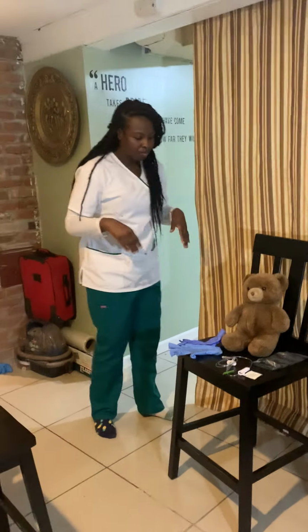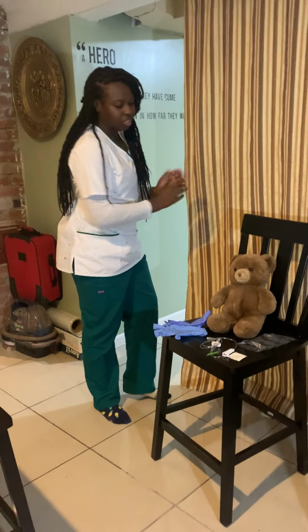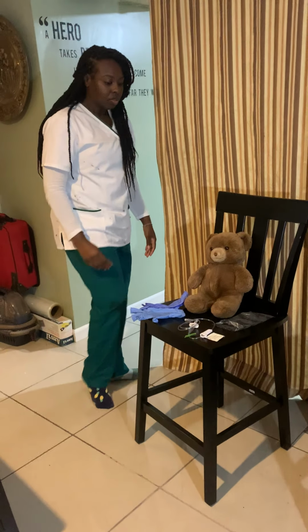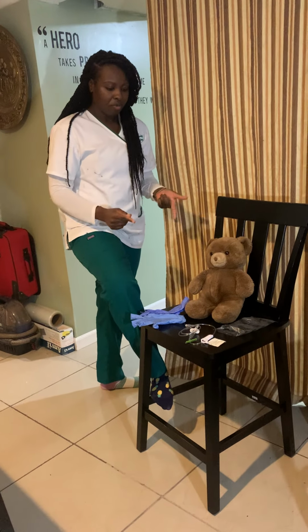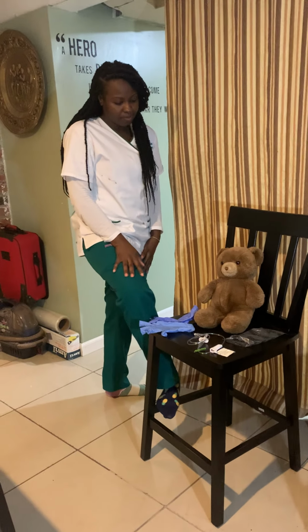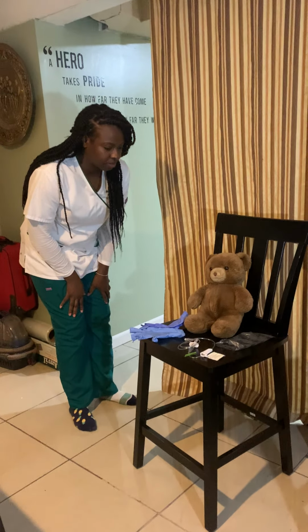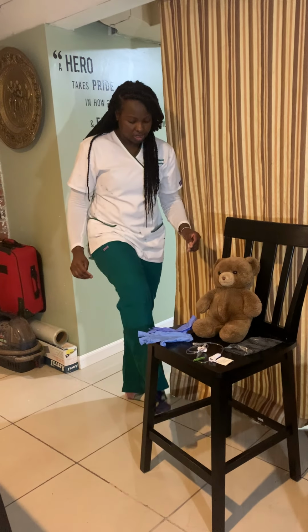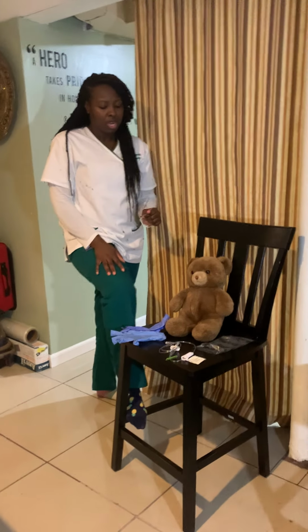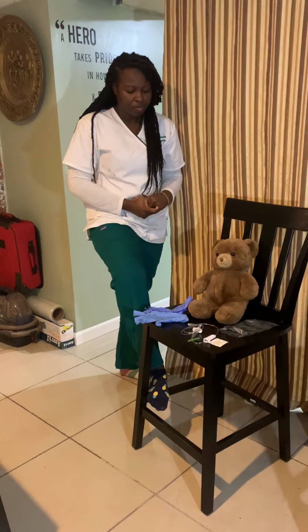Before I continue, I'm going to do hand hygiene once more. And I'm just going to tell you why I'm here today. So today I'll be administering IV piggyback solution of vancomycin, which is an antibiotic medication. And this is to treat your urinary tract infection. This is going to be due to the report in your urine analysis and your blood culture and CBCs. Okay?